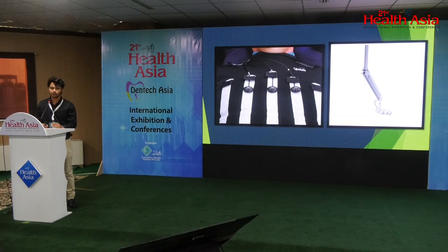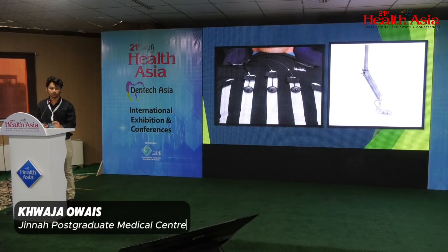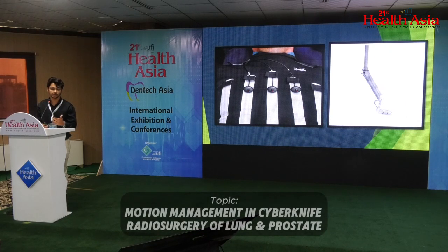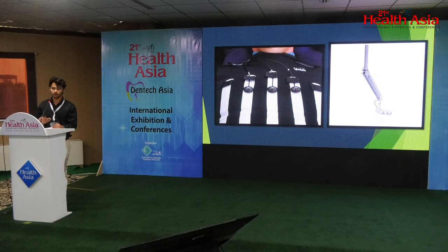Now, after we have done the fiducial implantation and we are ready for the patient treatment, we make the patient wear a specialized vest called the Synchrony vest. On top of the vest, we attach LED markers which emit a frequency detected by a special camera that is part of the Cyberknife equipment called the Synchrony camera. Now, if we are treating chest tumors in the thoracic region, we place these markers near the chest. If we are treating abdominal tumors, we place these markers near the abdomen. As the patient breathes, these markers breathe along with the patient, and then the respiration is recorded.